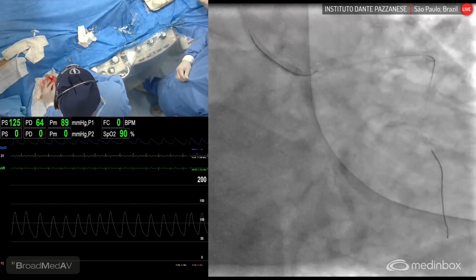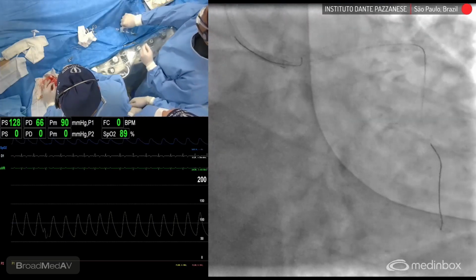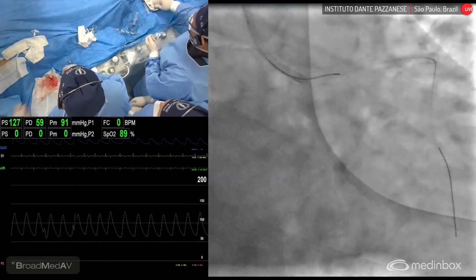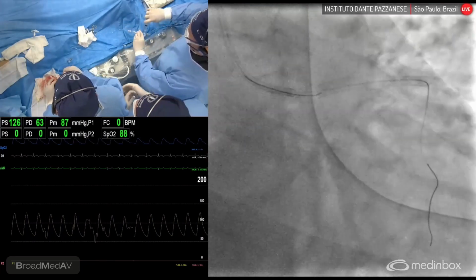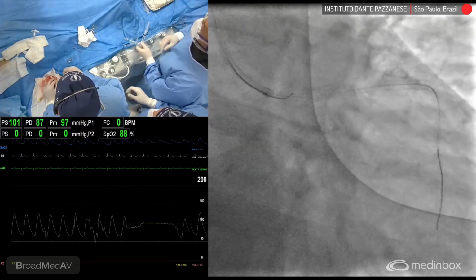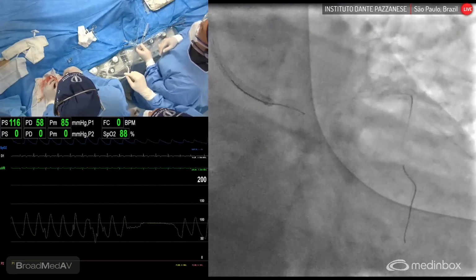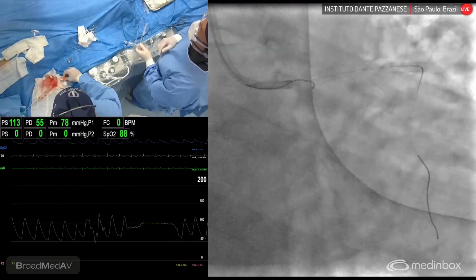Rodolfo, I have done some bench studies and also animal models, and it looks like when you're using this technique, even though you don't have a real crush here because you have a nano crush, what do you recommend? Try to recross by the mid cell or distal cell? Does it make a difference if you use two stents?